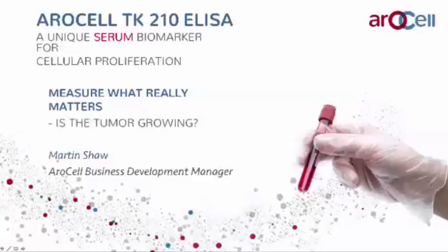All right. What are some cancer cell proliferation biomarkers in leukemia? Well, that is the type of studies and use that is presently the major one for the activity assay. The TK Liaison, for instance, is used, and has been for many years in several different clinics just for this purpose. So it's definitely there to be used mainly for monitoring treatment in leukemia and detect recurrent disease. Okay, thank you.